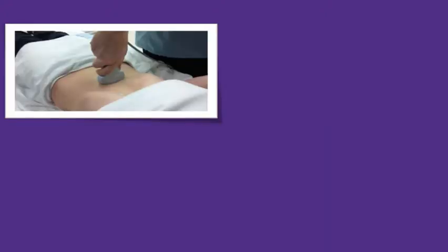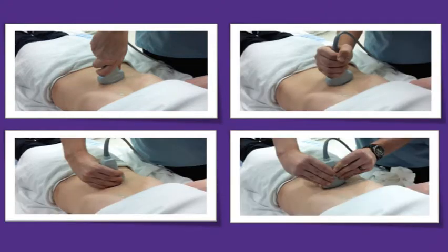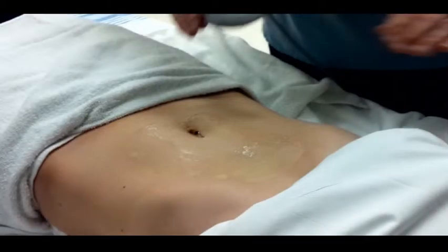Here are several examples of less than ideal technique, most of which are uncomfortable and don't allow precise movement of the probe. These should be avoided. So let's have a look at a real-time scan of the aorta. Here you can see some gel has already been placed on the patient's abdomen, although as you first start out, you might consider using quite a bit more. This will allow you to improve the contact between probe and skin, minimizing interference from air.